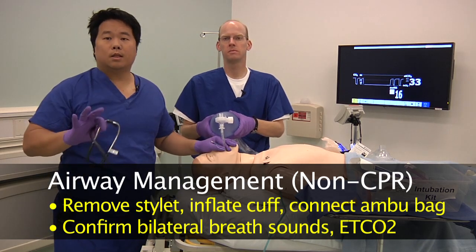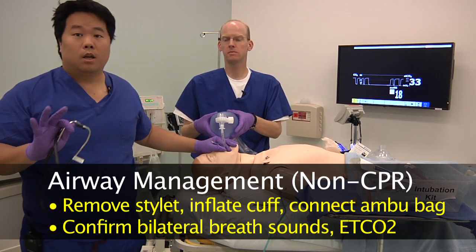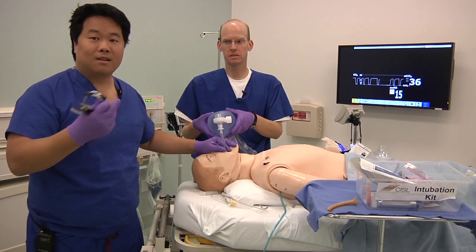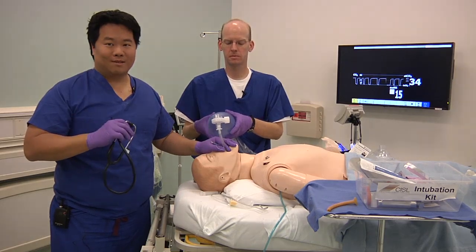And most importantly, you should check for end-tidal carbon dioxide using continuous CO2 monitoring. And that is airway management in a non-arrest situation.